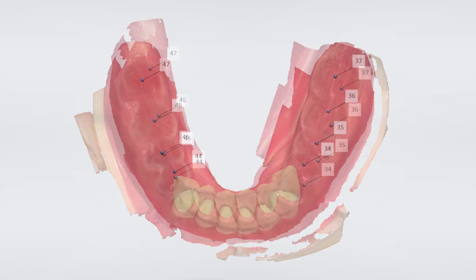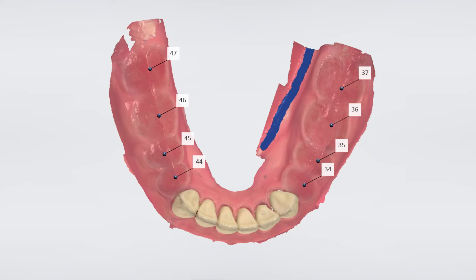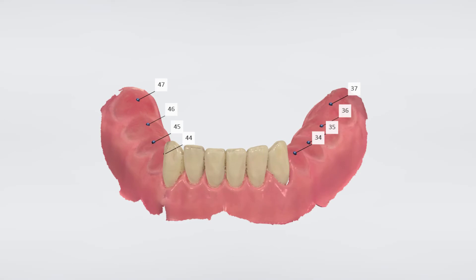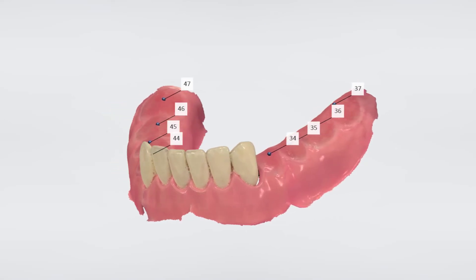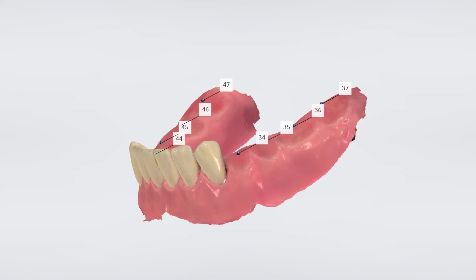In some cases, and especially for edentulous cases, we need to use anchor pins in order to stabilize the guide. Now we have a good, accurate surface to initially insert the guide on, starting on the front teeth, changing to tissue support in the posterior areas.